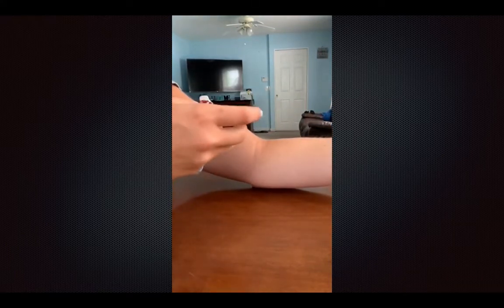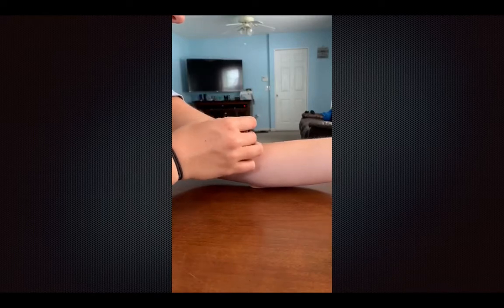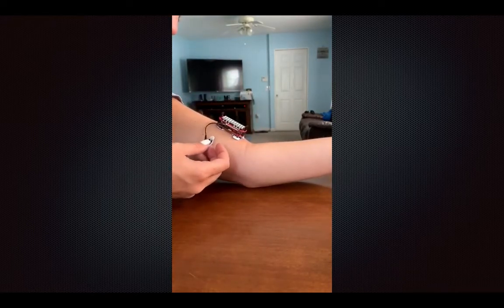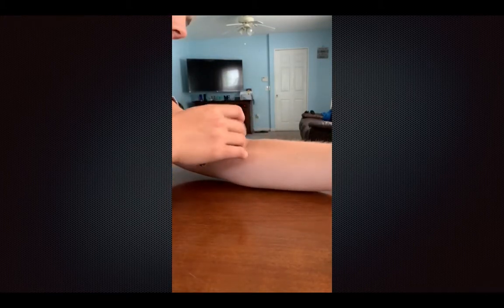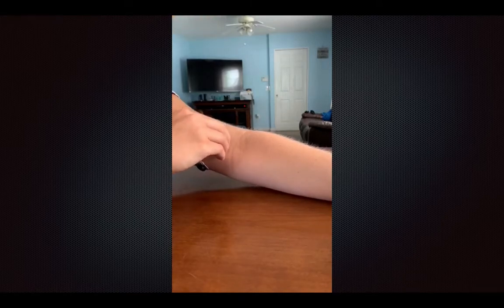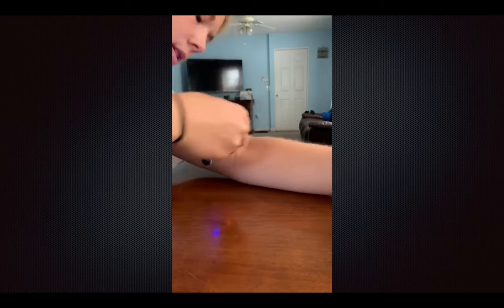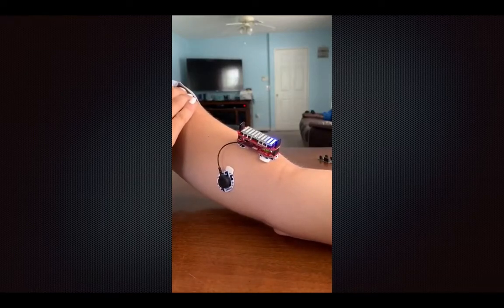So when you put it on the muscle, you want to do it along with the muscle. So like I said, this part goes in the front, back, and then supporting. So I'll turn this on first just to show how this works. But basically, it just senses when the muscle is flexed or not. So right now, it's not flexed.